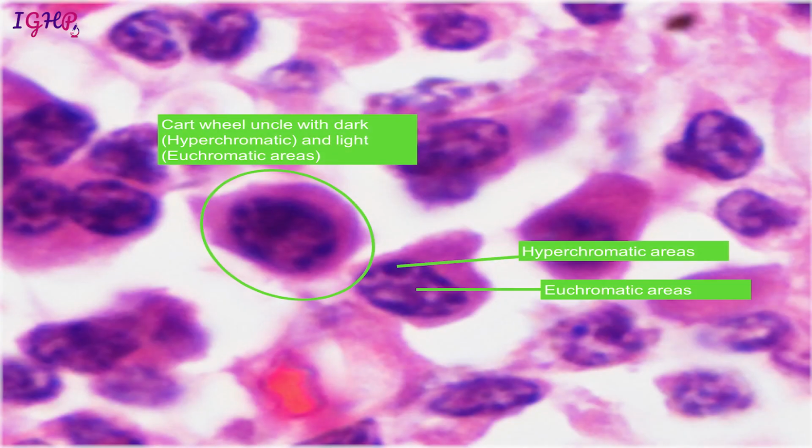And then there are certain specific types of cells like the melanomas, which could assume any of these shapes. So they are also called the mimickers. The melanomas are known as mimickers because they can take the shape of any type of epithelial or mesenchymal cells. Now once we have identified the type of cell present in the slide, the next thing to look for is the nuclear features. The most important thing is how the nucleus is looking. Is the nucleus looking benign, or is it showing some change which can put it into a malignant category?